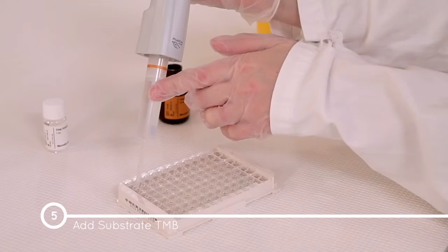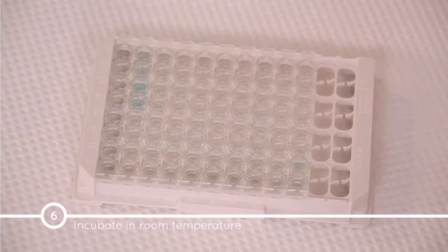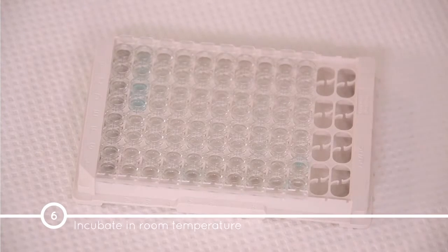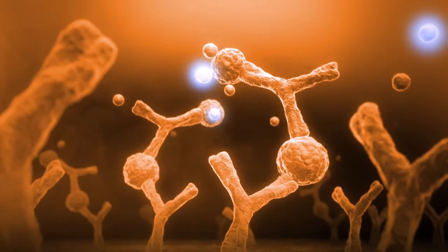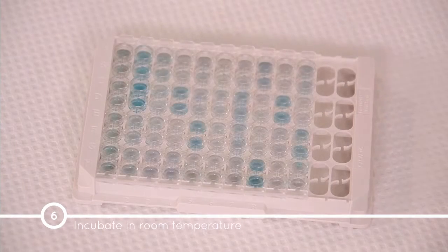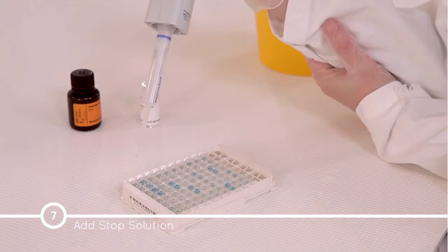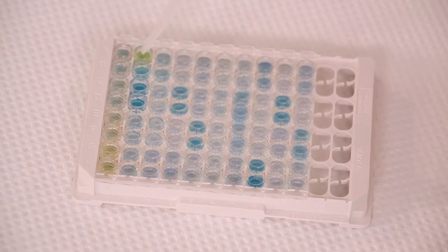Change the pipette tip and add 200 microliters of substrate TMB into each well and incubate on the bench for 15 minutes at room temperature. The substrate is converted by the enzyme to a chromogenic signal, and the wells that undergo a reaction will turn blue. After the 15-minute incubation, add 50 microliters of stop solution into the wells. The solution will turn yellow.